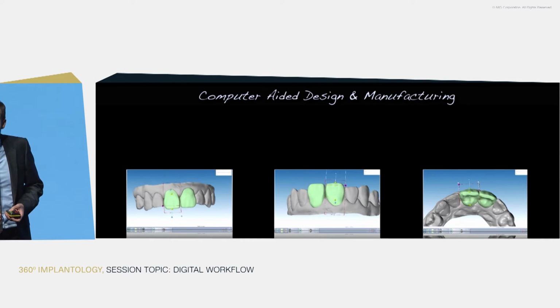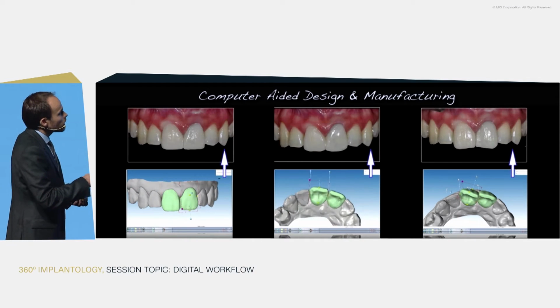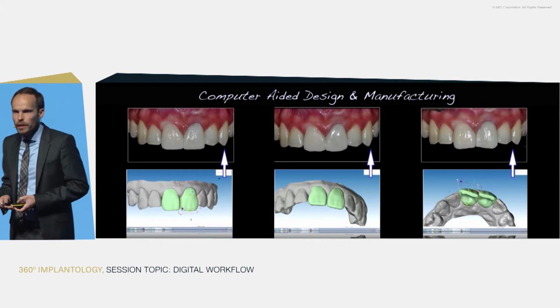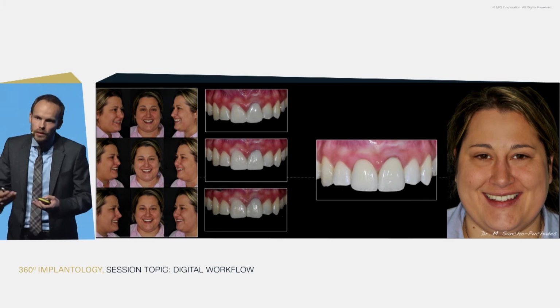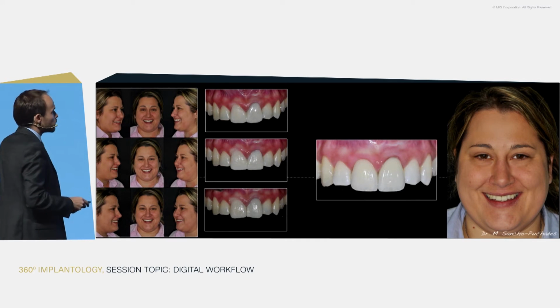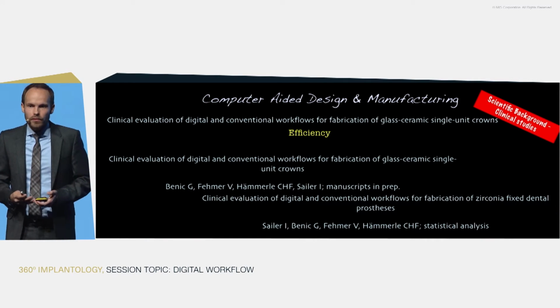So here are the advantages that we can see. For sure, we can do the same approach like you saw in the other cases. We can come up with 2 or 3 of these try-ins for the patient and provisionals, and finally finish the case with a small buccal veneering, and again, a case by Manuel Sancho. But does this give any benefit for us?